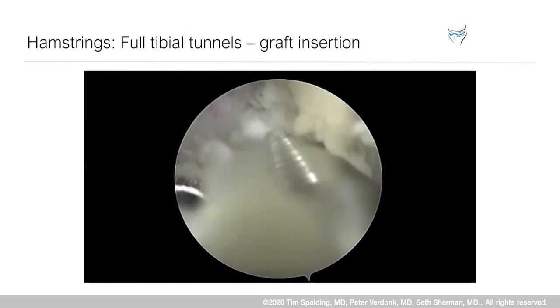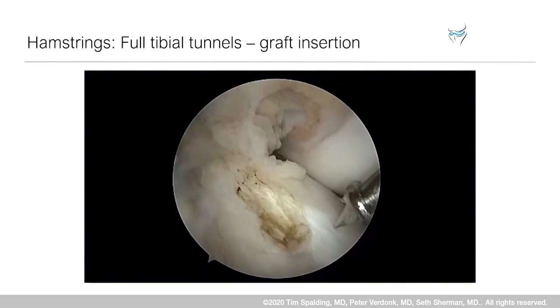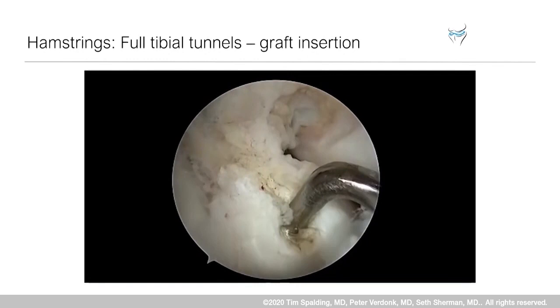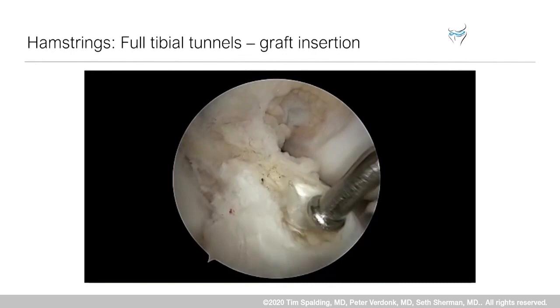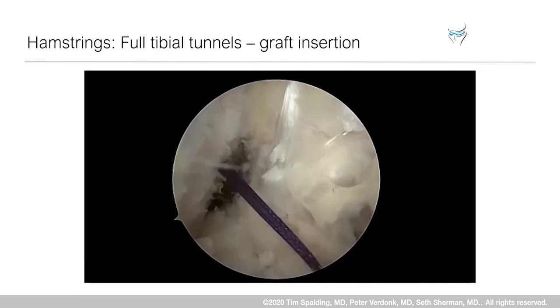Here we're just short of 40 millimeters, then reaming with the drill to 20 millimeters — the depth of insertion of the hamstring tendons. A loop suture is pulled through and left in the knee while preparing the tibia. The guide is set just posterior to the anterior margin of the lateral meniscus on the downslope of the tibial spine, then from outside-in drilling the guide wire before using the drill size to match the graft and retrieving the loop through the tibia.